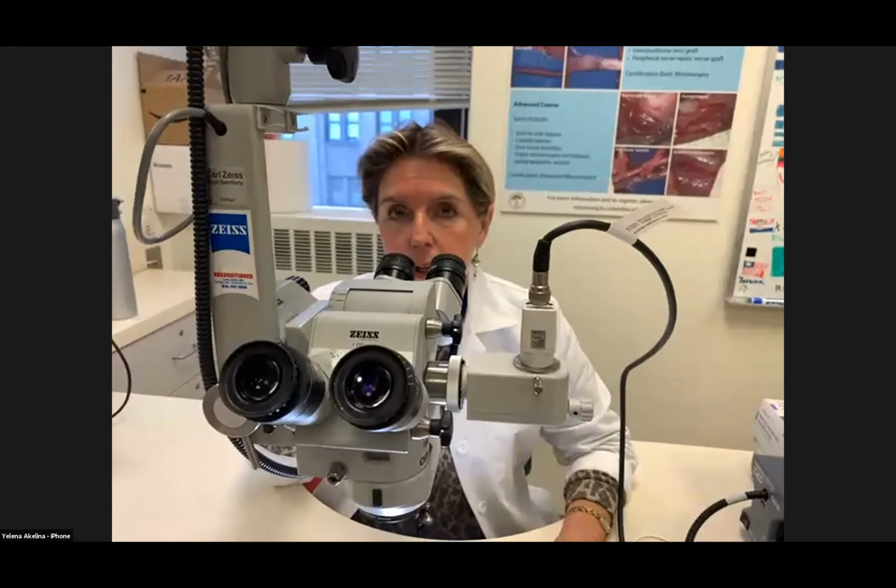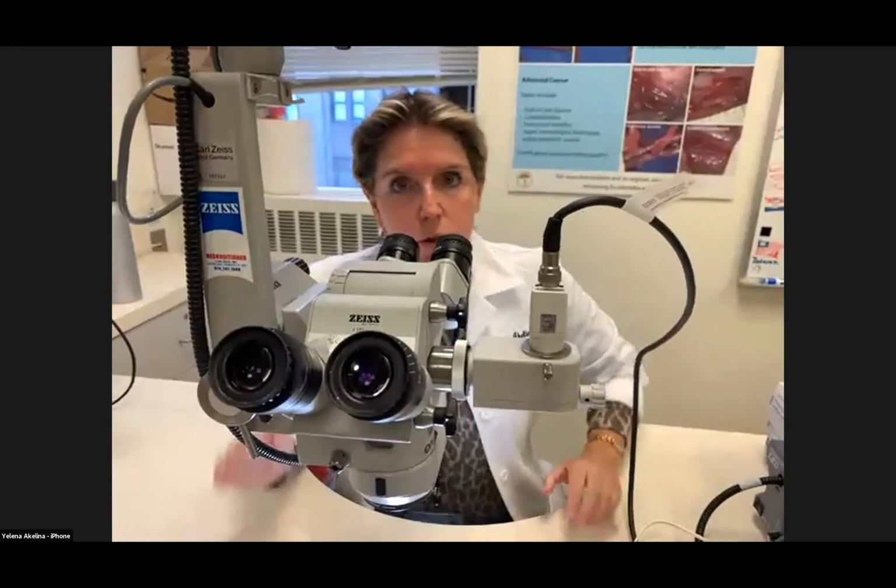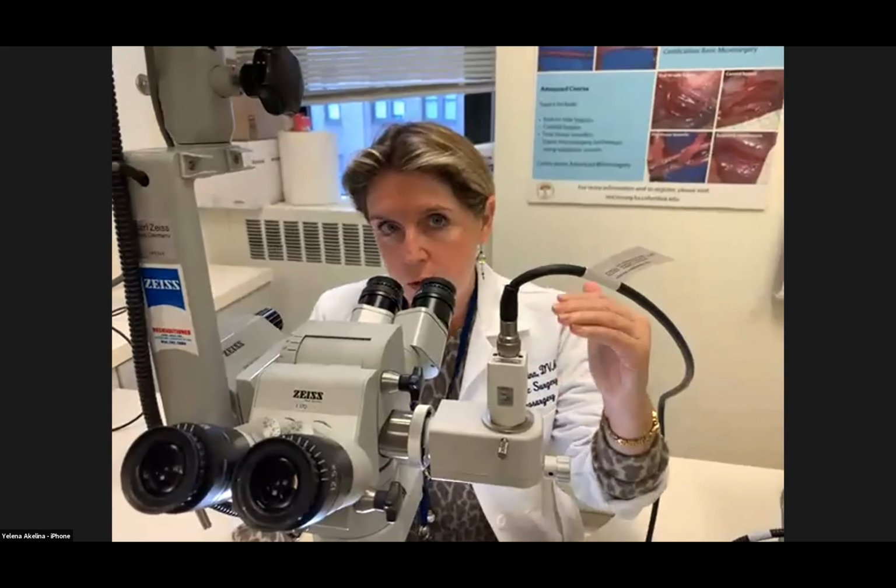Okay, I think that's clear, right? And then you don't really focus anymore. You just zoom in and zoom out.